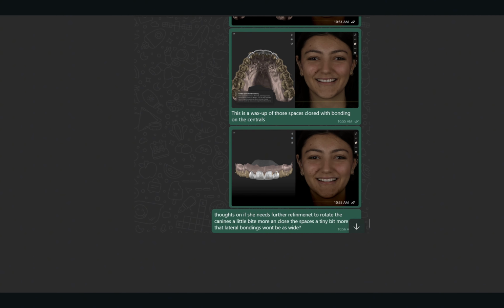And I know they say that you can design an incredible smile design in less than 4 clicks. But for my colleague who is overseas, you can do it in literally 2 words. This was a case of orthodontic space closure. However, we were also planning on doing some bonding afterwards.